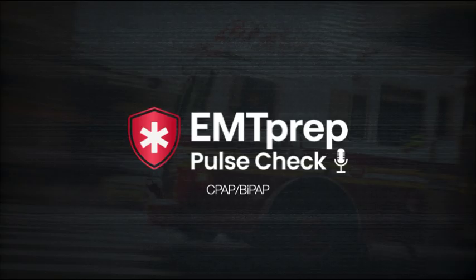So BiPAP, or Bilevel Positive Airway Pressure, provides 2 pressures, as we've previously discussed, an inspiratory pressure and an expiratory pressure. Because asthma and COPD are considered air-trapping conditions, having a lower pressure against which the patient has to exhale, so that EPAP, can help improve ventilation and gas exchange, which is why it's the preferred method over CPAP in asthma and COPD patients. All right, time for our final question.